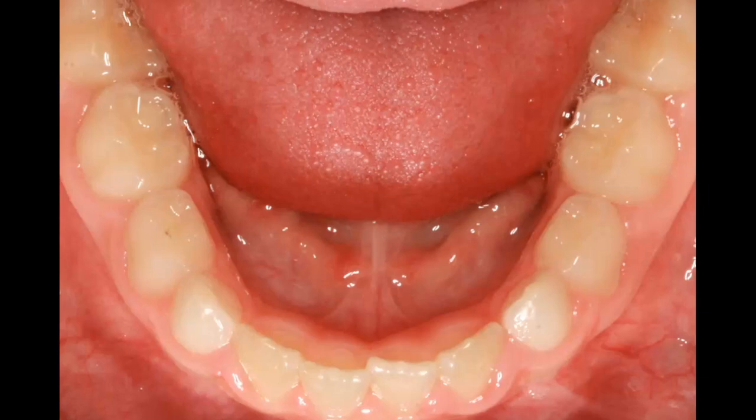Not really much as far as the teeth relate to the jaw. Does that make sense? Meaning the jaw is growing to one side, but the teeth within the jaw are just moving along with whatever's happening at the condyle and the ramus, right? So if you're looking just at this photo here, whether it was asymmetric growth or whether it was a shift in the mandible, doesn't matter. I mean, it's going to look the same from here, right? We don't really know.